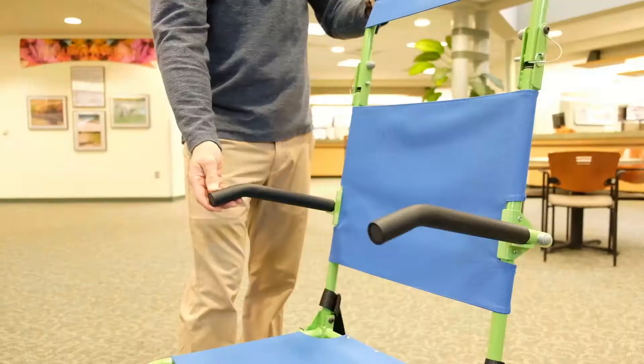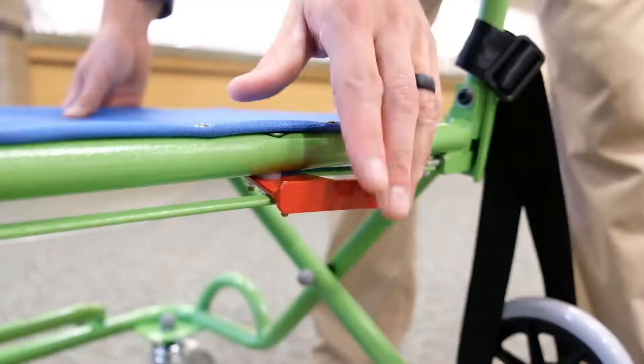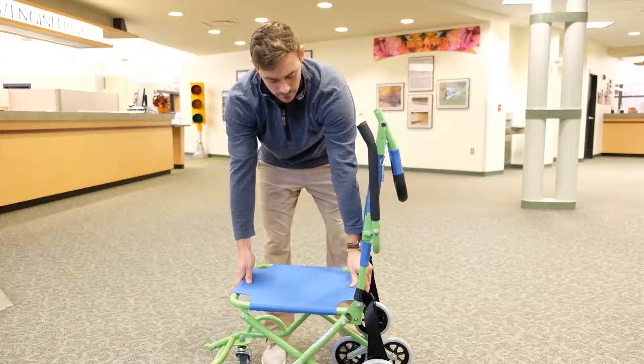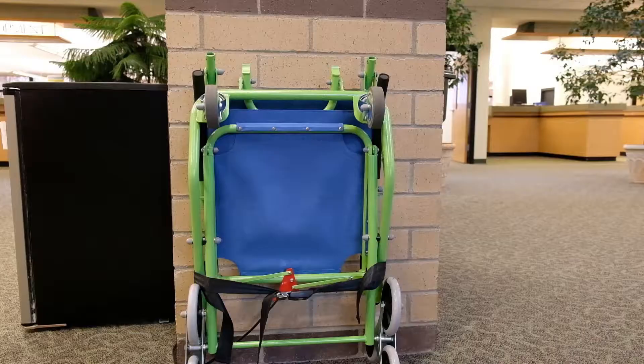To return the three wheel chair to storage, begin by folding the footrest and armrests back into the closed position. Next, remove the safety pins on each side of the handle and fold the handle down. Lower the chair to the ground into a folded position and then fasten the safety belt around the folded chair to secure it. Return the chair to its storage position ready for its next use.